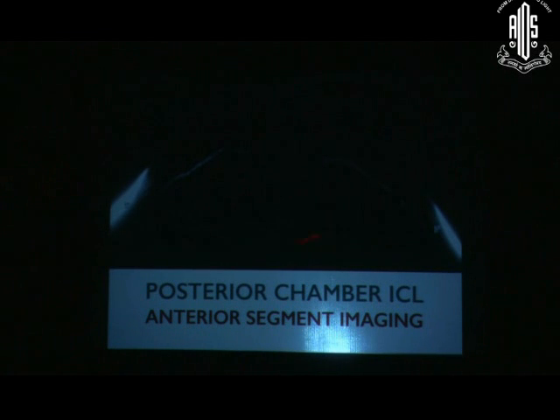Now in this case, a posterior chamber ICL has been implanted, and we can see how we can calculate the vault. Also at the same time we can find out how much the iridocorneal angle is post ICL. So it helps in follow-up of the cases, especially for knowing whether complications can occur at a later time.